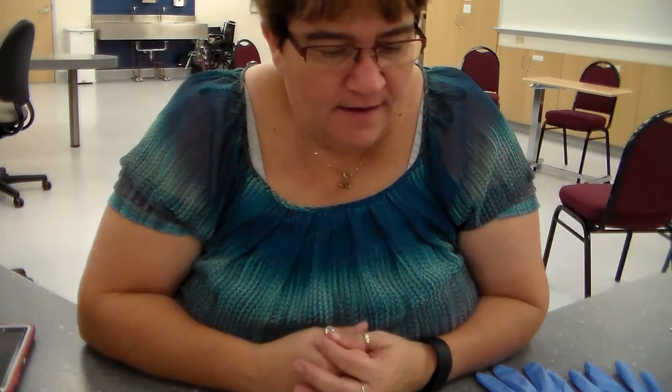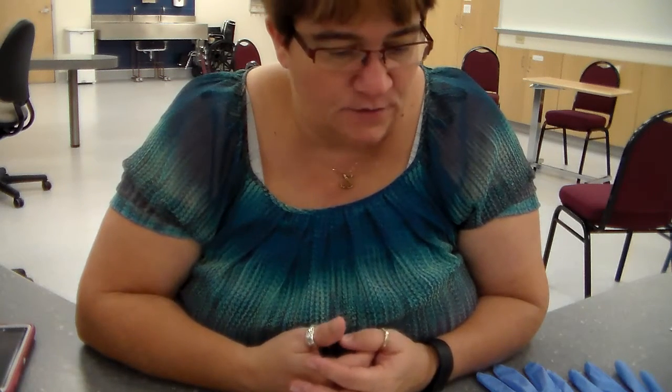All right, this is skill 2.31, administering dry powdered inhaled medication. Spiriva is a common one that's used, okay? So first of all, with any medication, you're going to check the physician's order and make sure that you have a correct order. Then you're going to gather the medication from the medication room or wherever the storage area is in your facility.